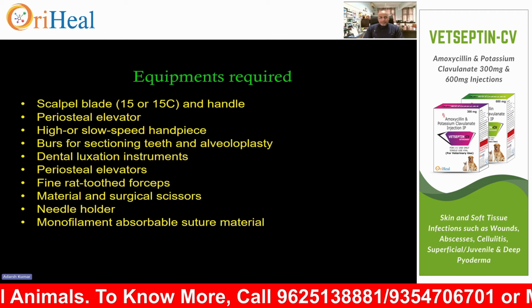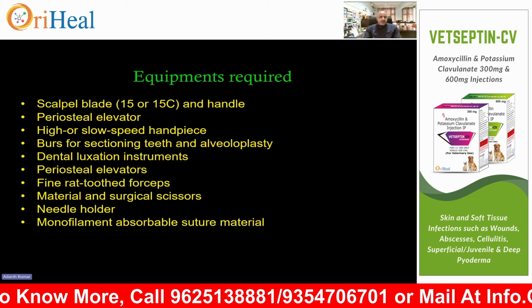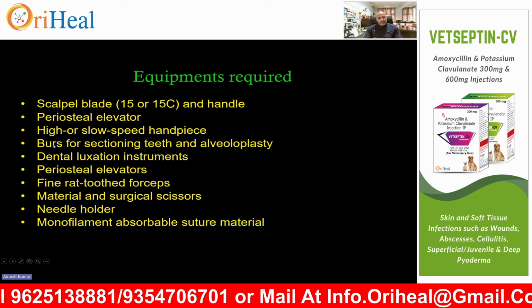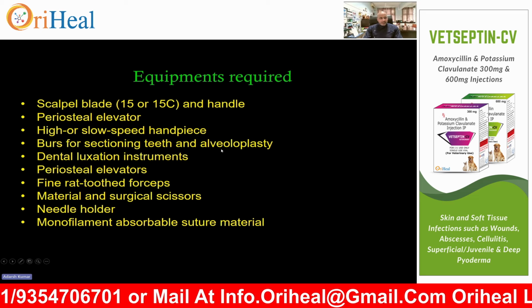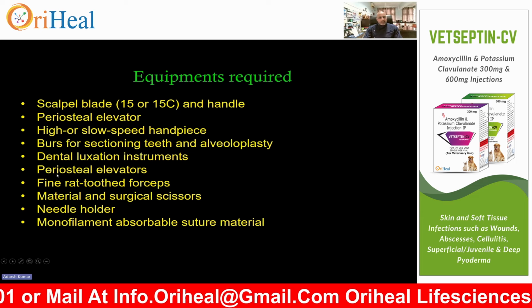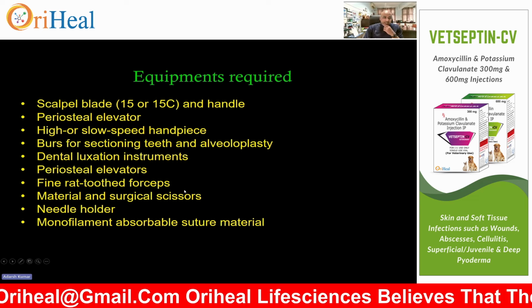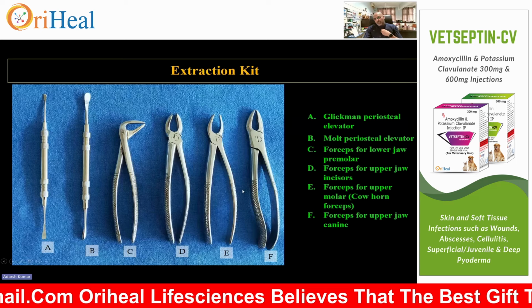So the equipment required: you need a scalpel blade, 15 or 15C with handle, then a periosteal elevator, high or low speed hand pieces specifically made for dentistry purposes. Then burrs. I'll tell you what kind of burrs are required. Then dental luxation instruments, periosteal elevators, a rat tooth forceps for holding the soft tissue, then certain materials like suture threads, needle holder, and surgical scissors. One by one, let's cover it.